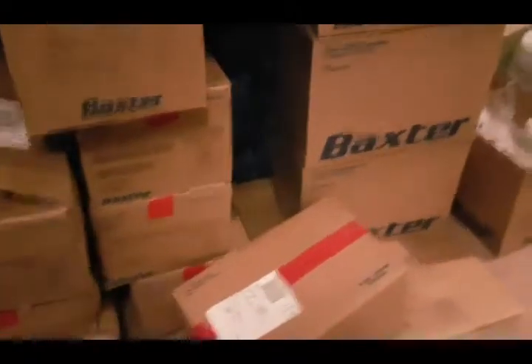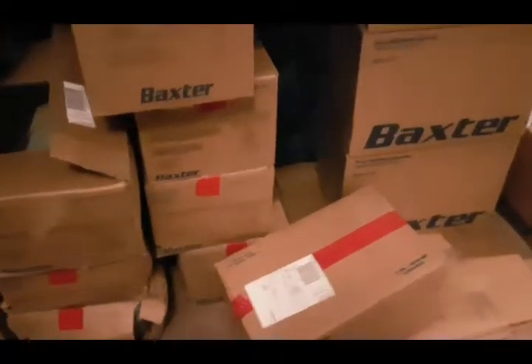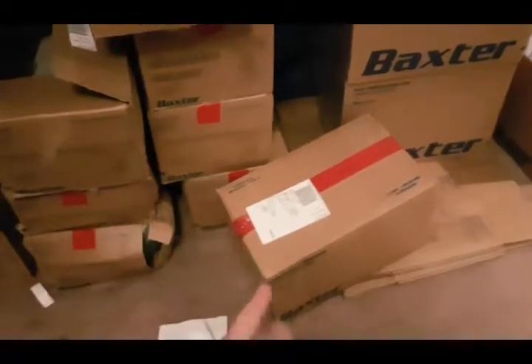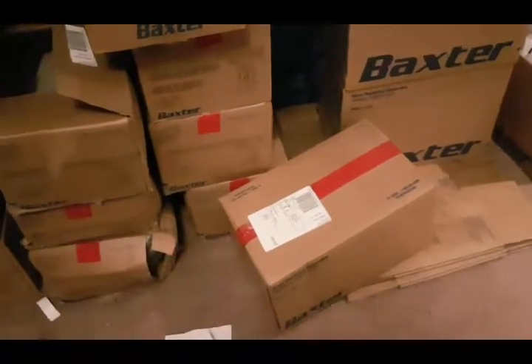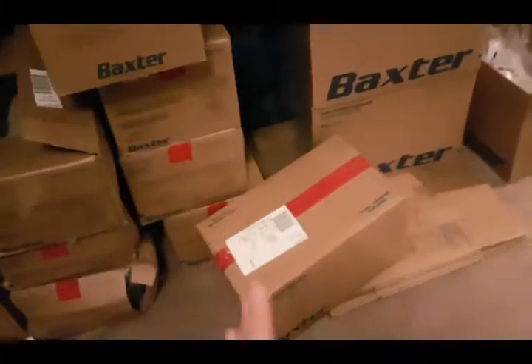Over here we have more of the dialysis solution, and this is the 4.25%. Now, my dad uses all the 3 different gradients plus the purples, which is 7.5%. There's a lot of medical mumbo jumbo, which I do not have the technical terms for, and my dad can explain more about that later, which I will leave up to him because I don't know everything. I know enough that if he's in an emergency situation, I can help him with his dialysis and help him hook up, because he cannot go more than 3 days without it, or he will become septic. And even then, he's really miserable.